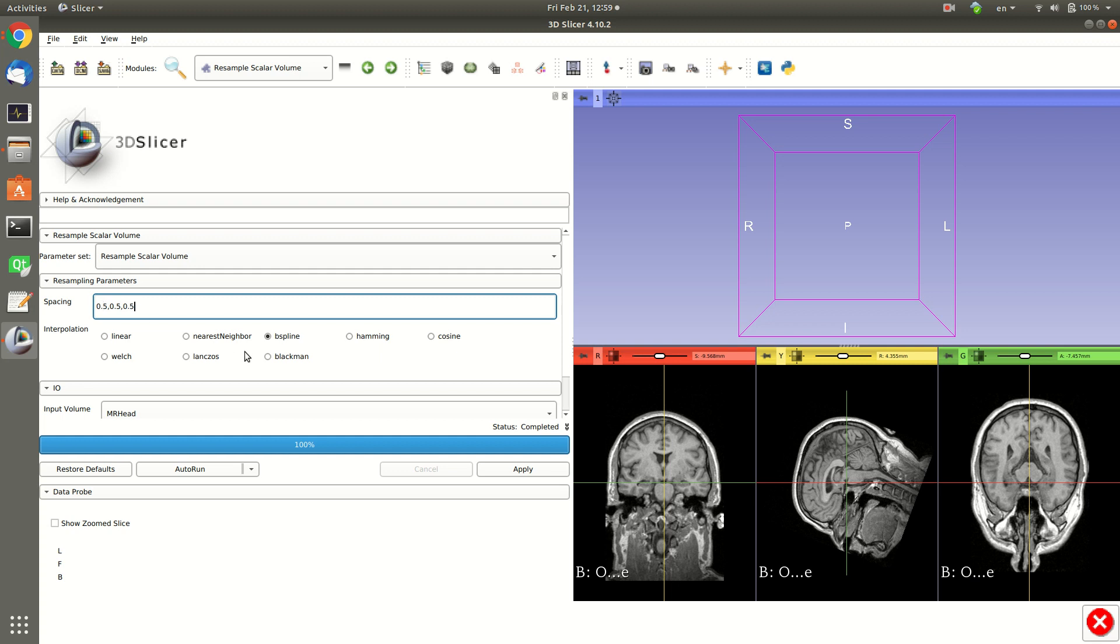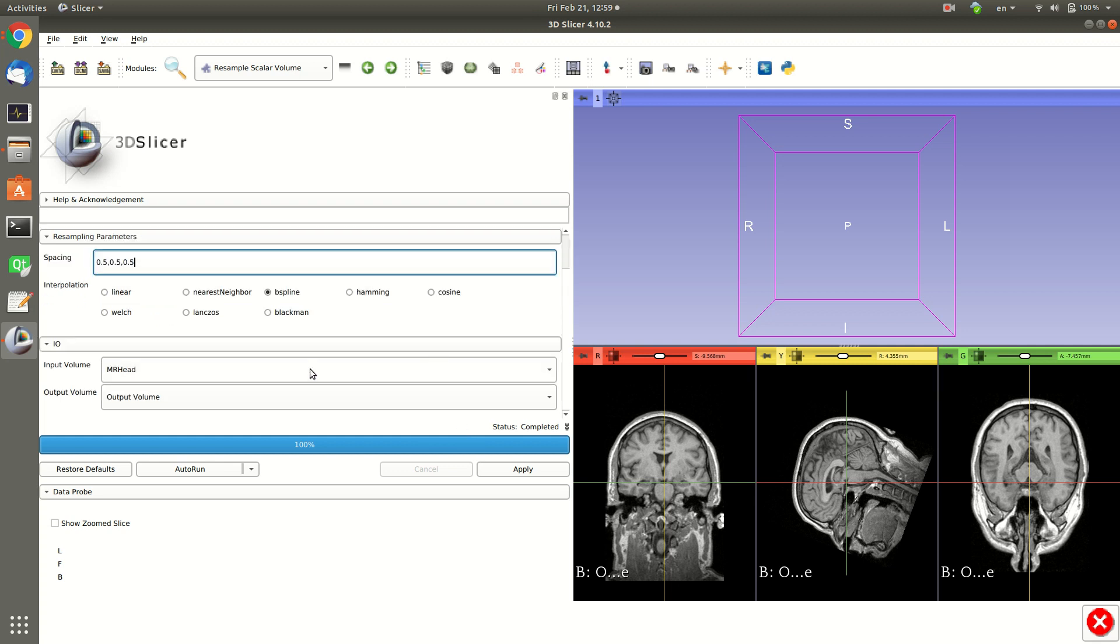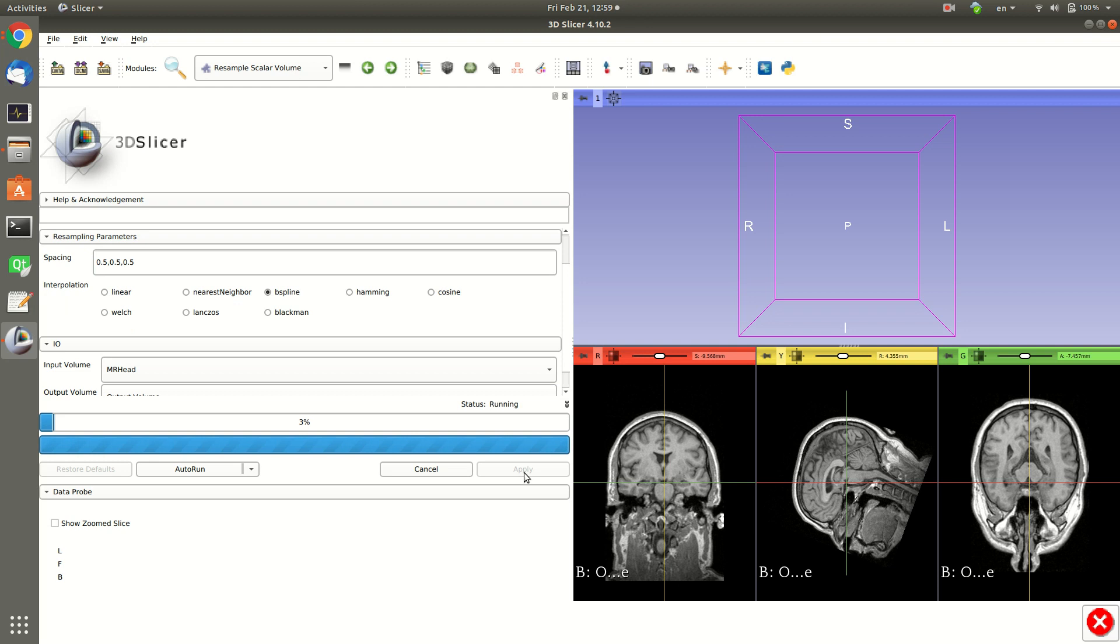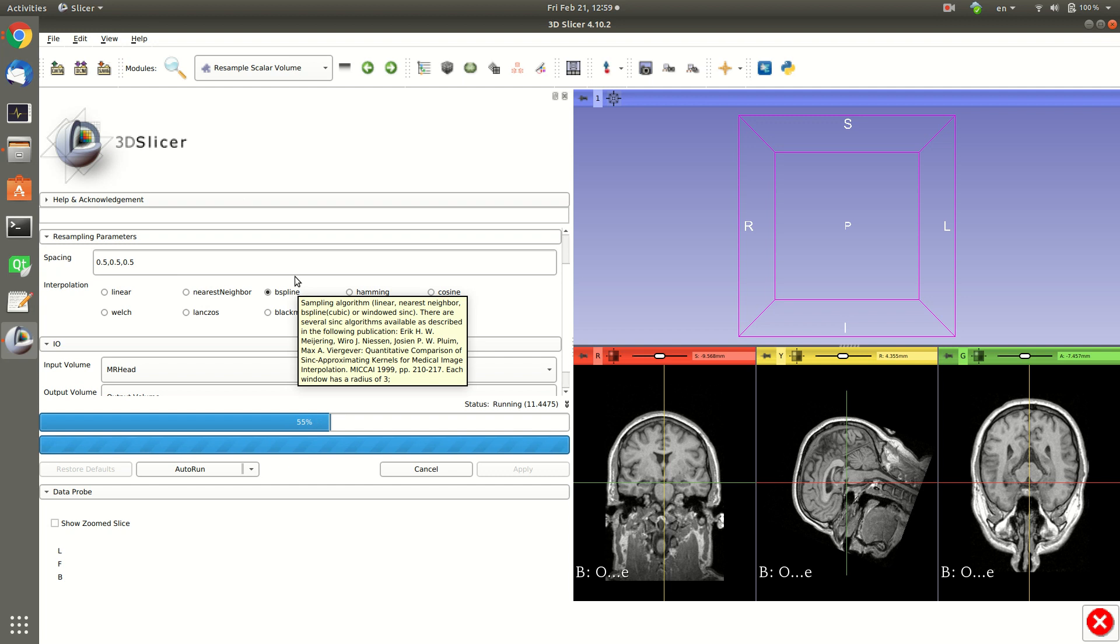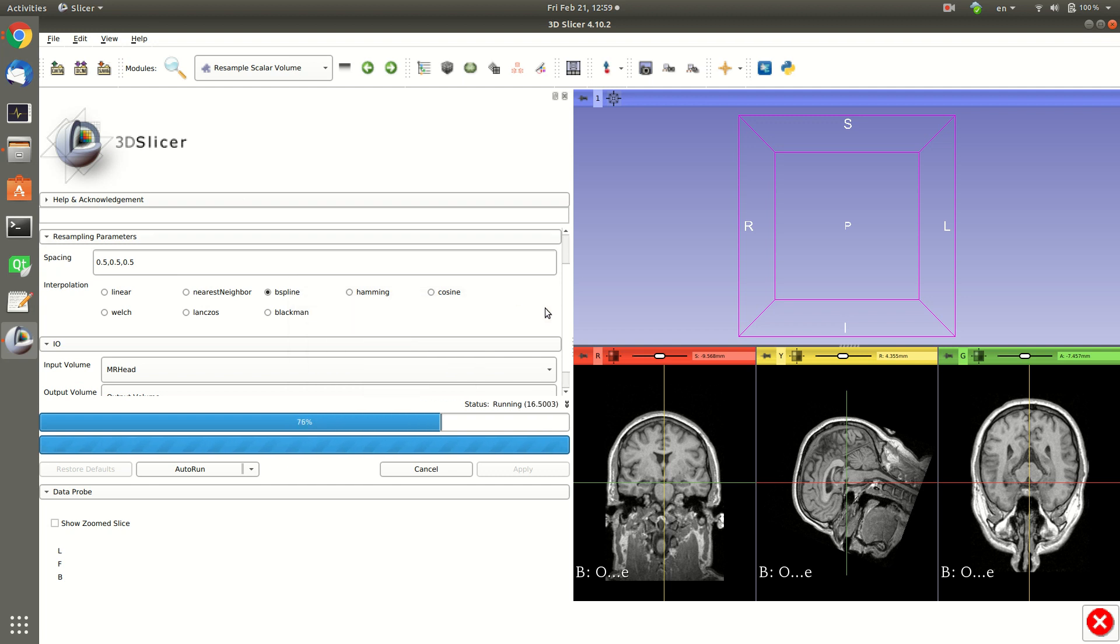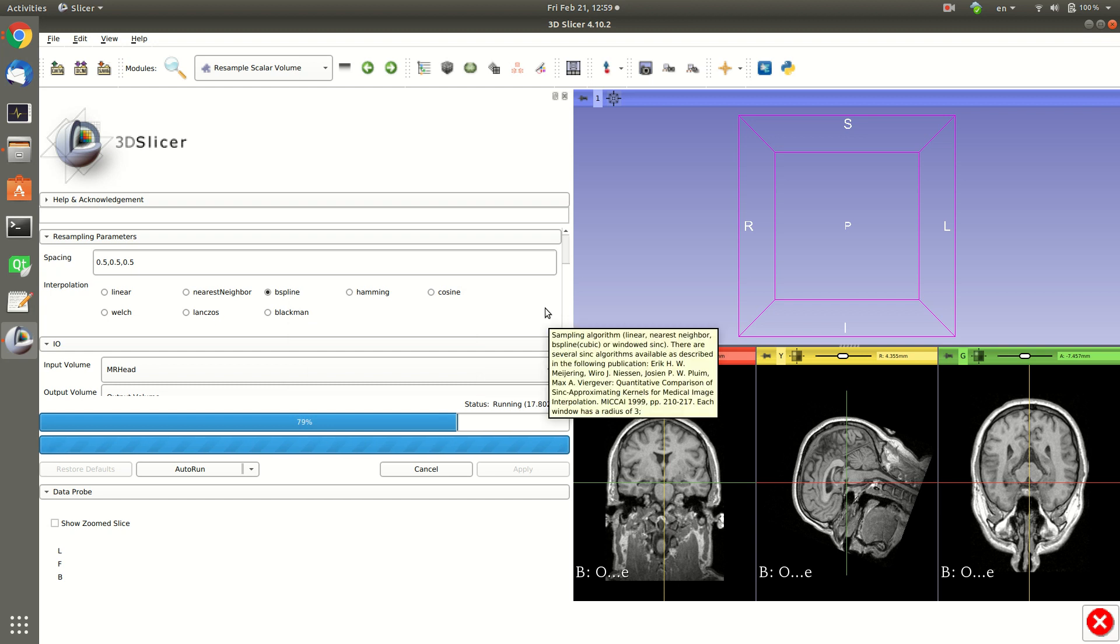So let's apply this on the output and see what will happen. So now instead of 1.1 and 1.3 millimeter spacing we will get 0.5, 0.5, 0.5.